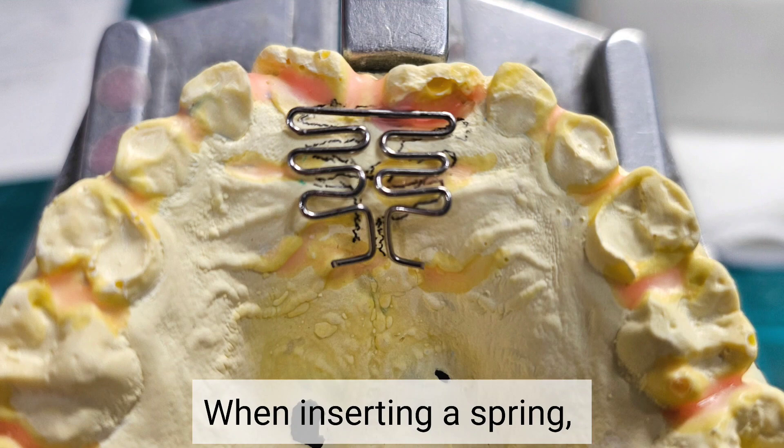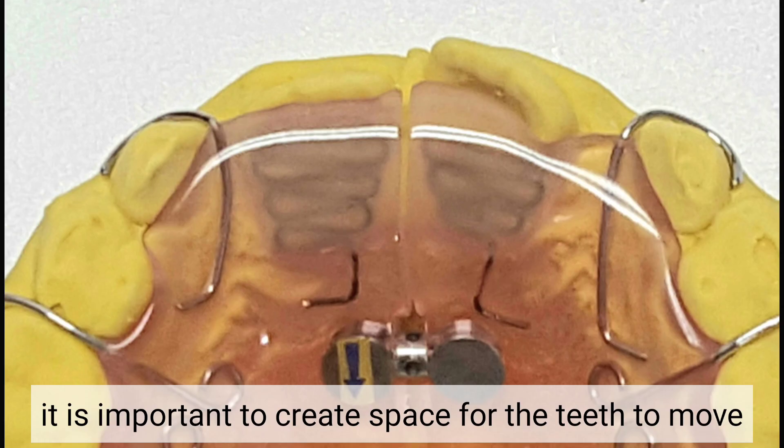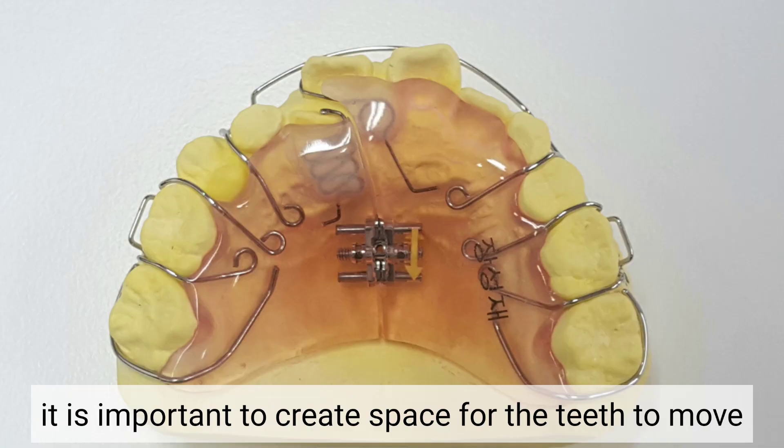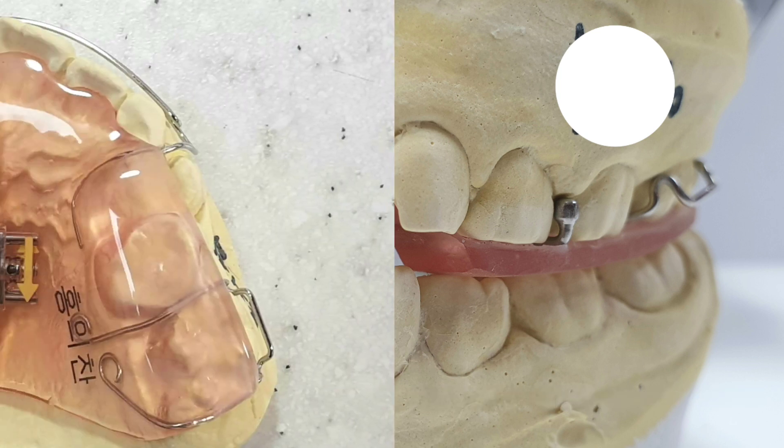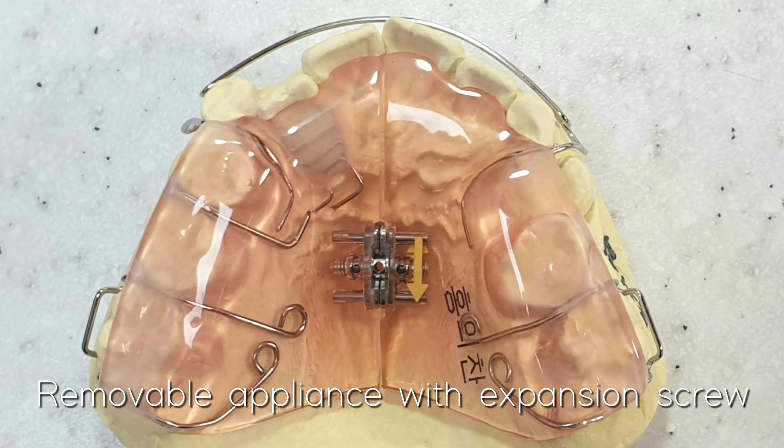When inserting a spring, it is important to create space for the teeth to move. If the opposing teeth are locked, it is effective to remove the obstruction with a bite appliance. And if there is crowding and there is no space for the teeth to move, it is effective to expand the arch and create space.